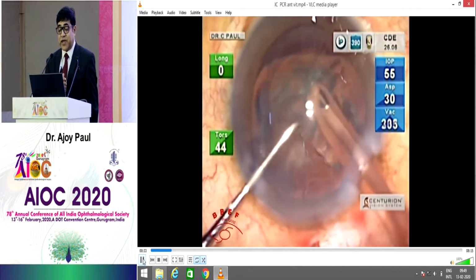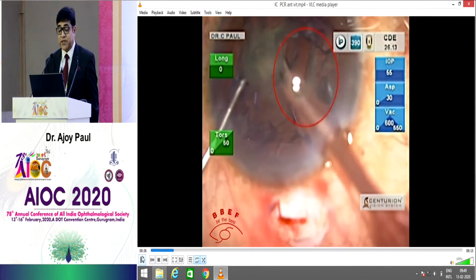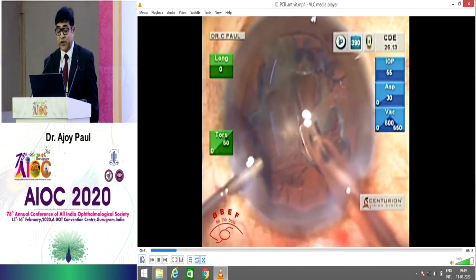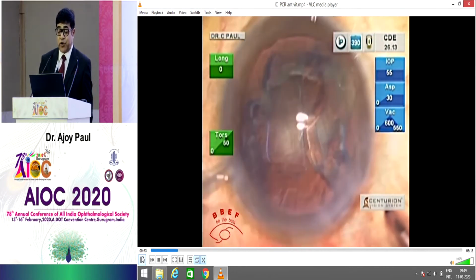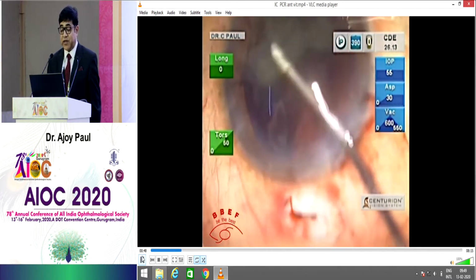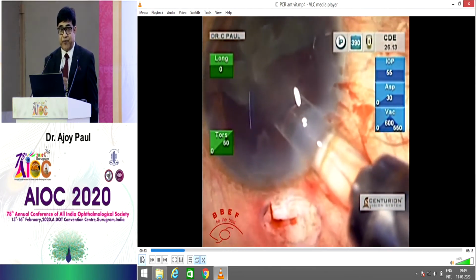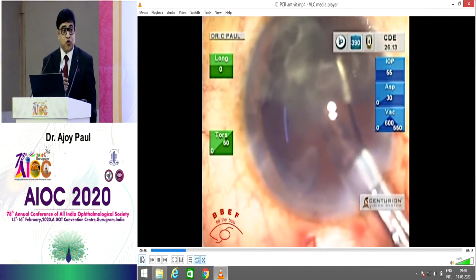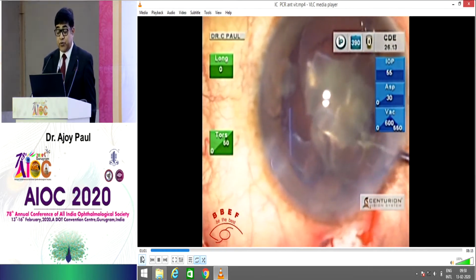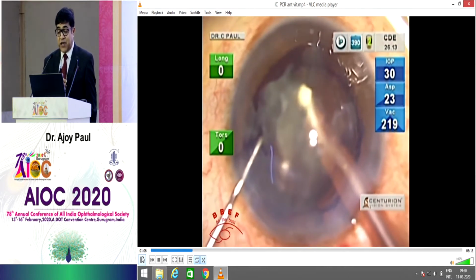That is because I realized that I've caught the posterior capsule and there is a small rent there. As you can see, this is the moment when you have to be alert. As Partha said, take a small breath. You cannot stop your surgery, but definitely all your senses are alert. I'm doing a bit of clearing of the lens matter, as Dr. Amar has shown us the IOL scaffold in these sort of cases, and Dr. Chitra also showed. Now this is the lens which I am dialing, putting it over the sulcus.